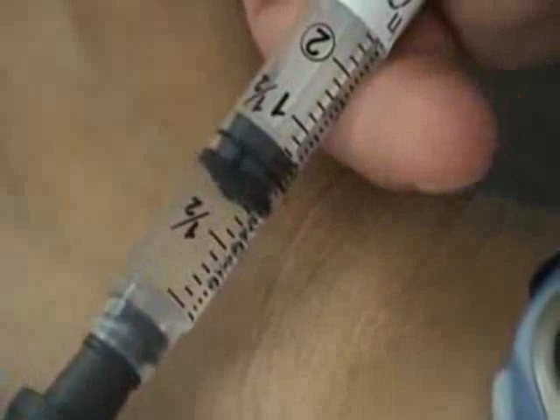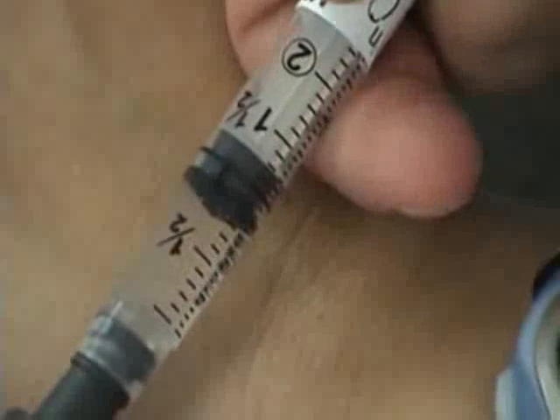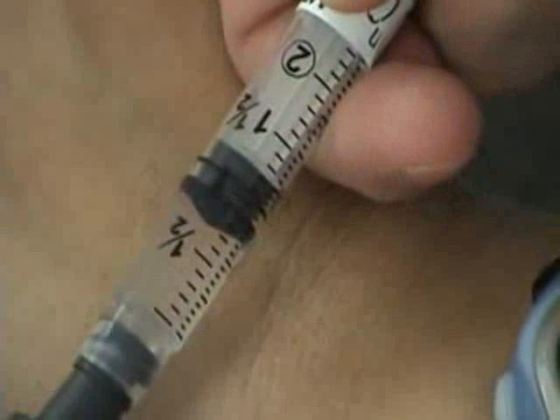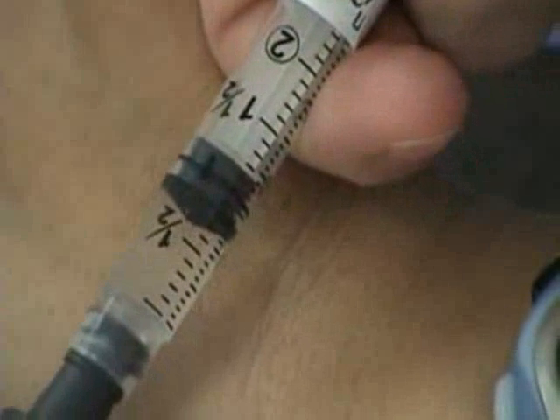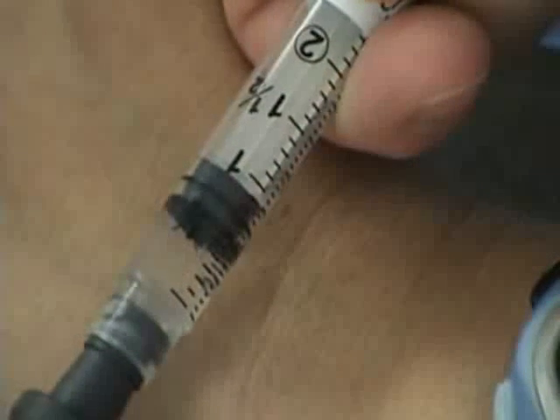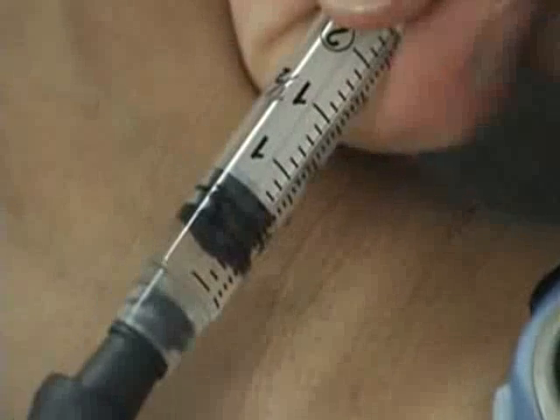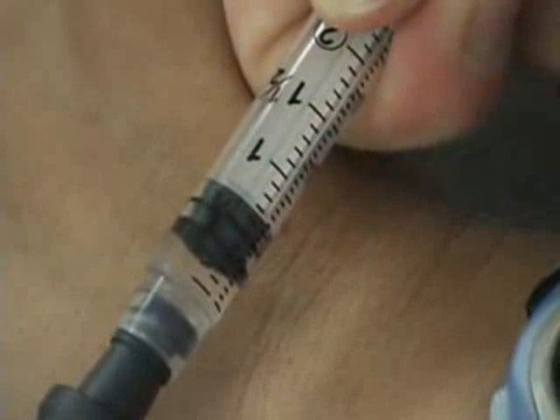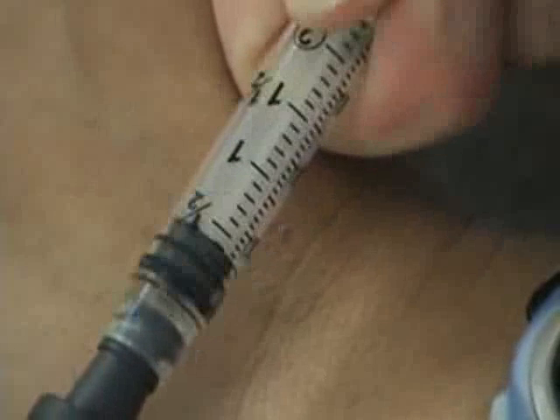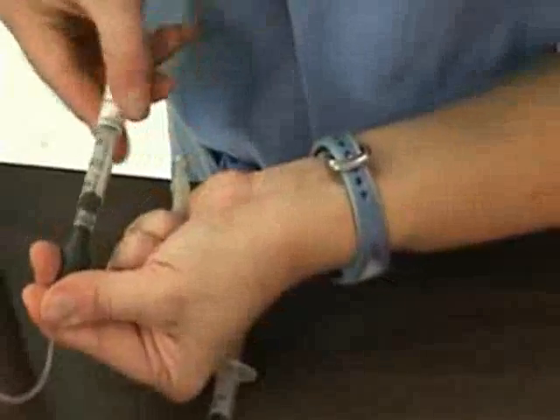It should take me 6 seconds of a continuous push from one line to the next. Now I will remove the syringe and place in the sharps container.